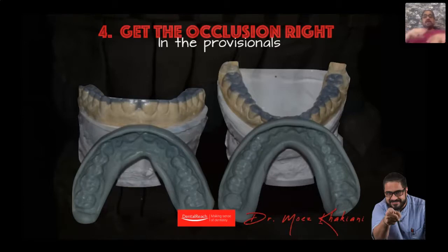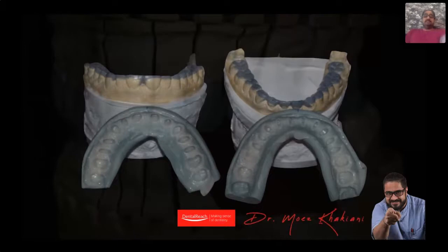So now what do I do? I made a putty index out of this. Into this putty index, I put a ProTemp 4 type material. It's a bisacryl material. Any company works. I love ProTemp 4. It's from 3M. After I'm done with all my preparations, I put this into my patient's mouth. I allow this to set. Now I go ahead and I adjust the occlusion. All right, this is my set of temporaries that have been made. I prefer to keep them joined together whenever possible.